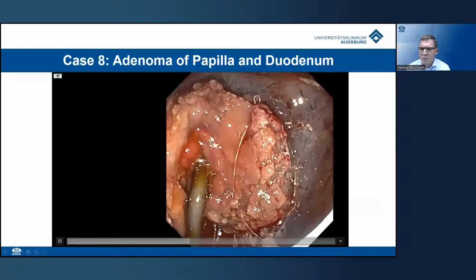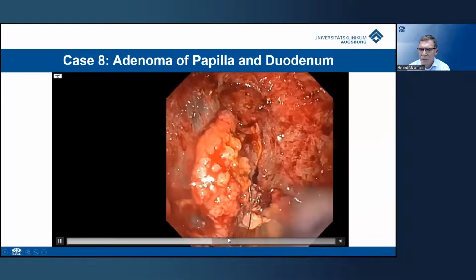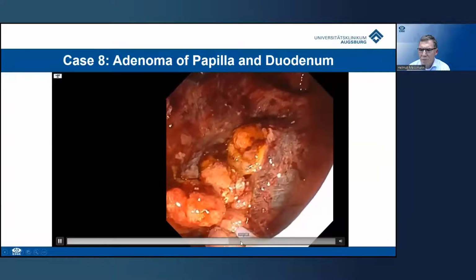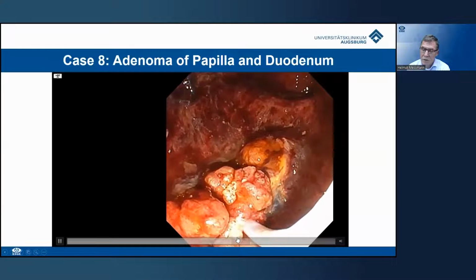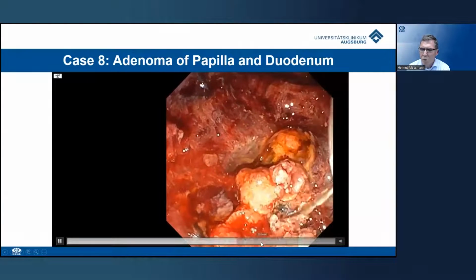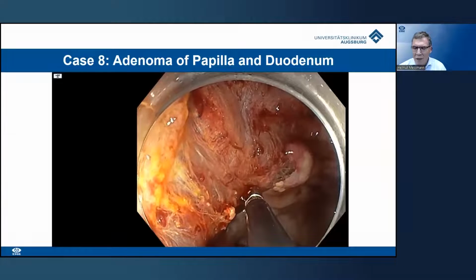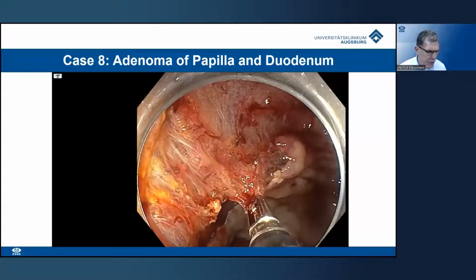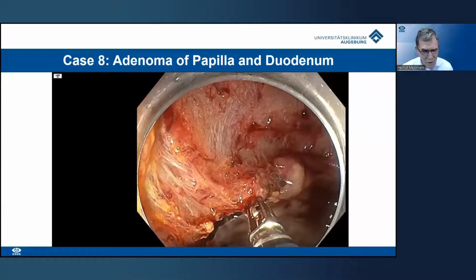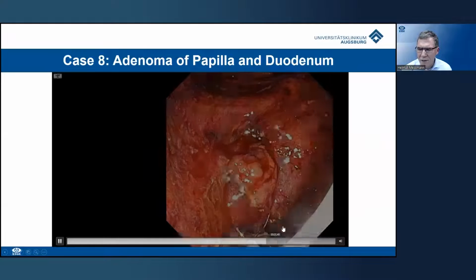There's the stent in situ. Then completing the resection, I removed the stent, and then I resected the papilla. You see here the resection of the papilla. And at the end, it was, I thought, well done. But you see, it's starting from smaller vessels, starting bleeding. It is always a question. Here is a spurting vessel. When to control? Usually we control the patients the next day. But in this situation, I decided I would like to have a control in the next 6 hours because we expect bleeding. We did some prophylaxis.